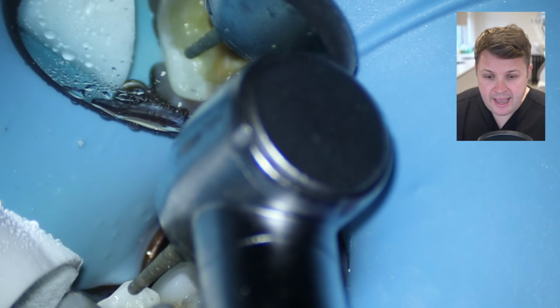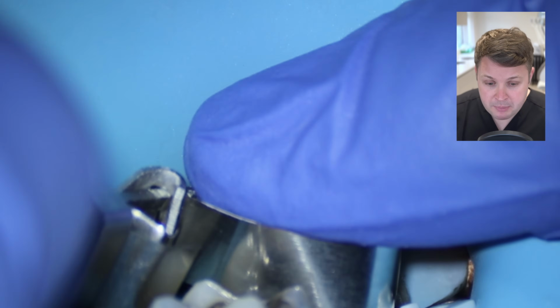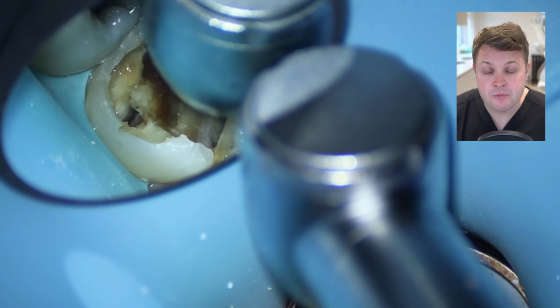just to remove it. And then I try to place a matrix band on this tooth, but the problem is the contact point between the two teeth is stopping us from doing this. So what I do is I try and place a bit of a wedge in there to try and open up the contact, but again, I try and place the matrix band on, and it doesn't allow me to push it down. So what I'm going to do is get a very, very finely tipped burr here just to remove the contact point.